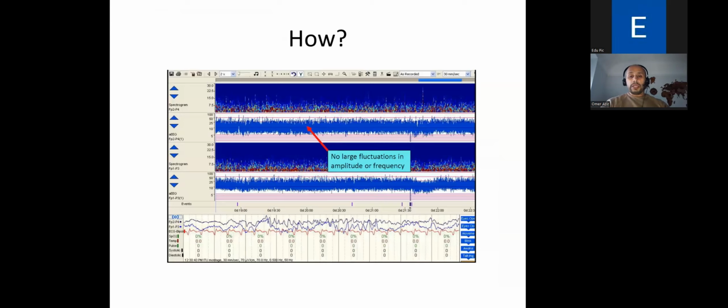The first one: you come and look at the screen. As I said, the top half of the screen represents 4 hours of EEG monitoring. You look at whether there are any significant fluctuations in the baseline of the CFAM, or the amplitude integrated EEG. As with this one, it's fairly stable in terms of baseline. You can get occasional dips and rises, but there's no massive up and down. In the bottom trace there's a slight dip here, but we'll talk about whether that's just sleep-wake cycling shortly.